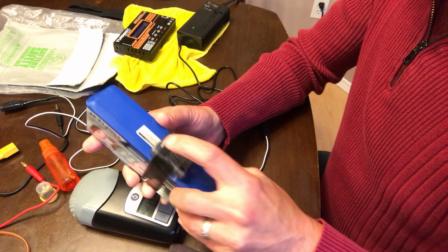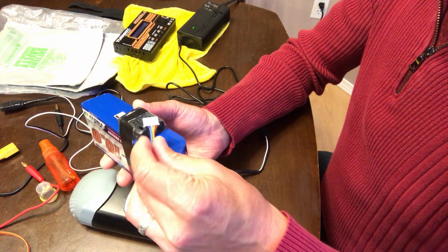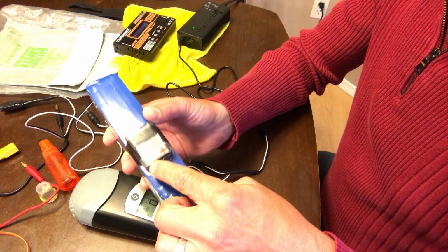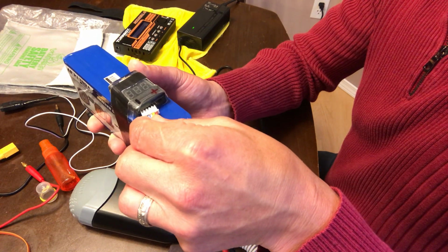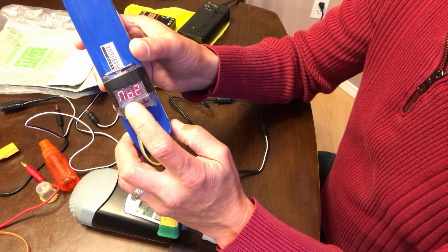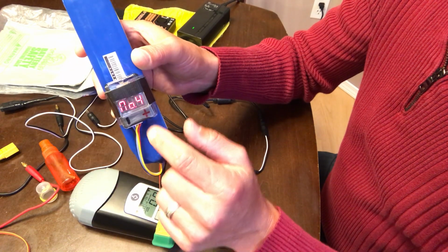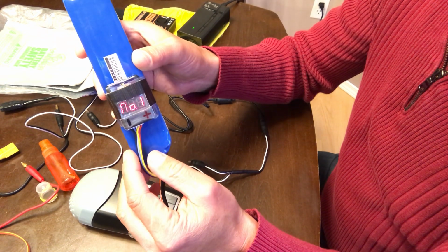So this battery also, I bought a couple really cool devices. One of the devices, also on Hobby King, was a voltage checker. So you take your battery, you have the red wire and the black wire for negative, positive. I've marked these negative and positive, and you just put that on there, and it'll say there's 4 cells. All of them are 15.1 volts. And then number 1, 2, 3, and 4, it'll go through each cell inside this pack and tell you what the voltage is. So right now I'm running about a 3.8 for each of the batteries.